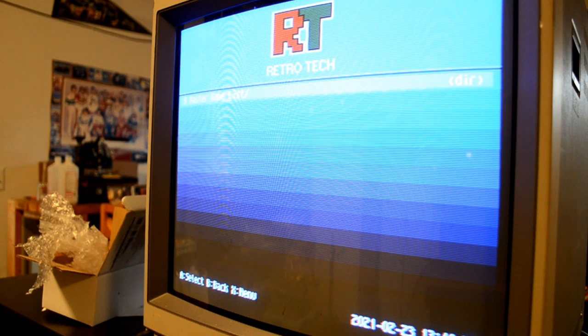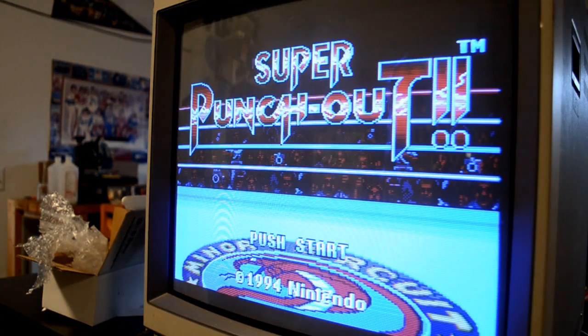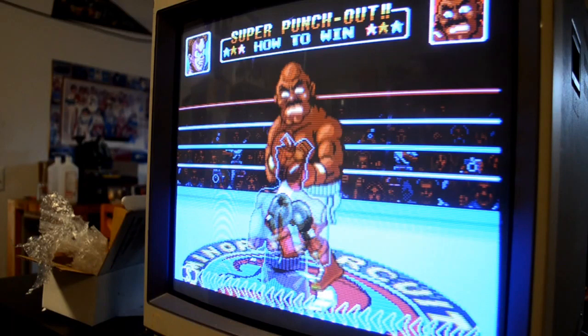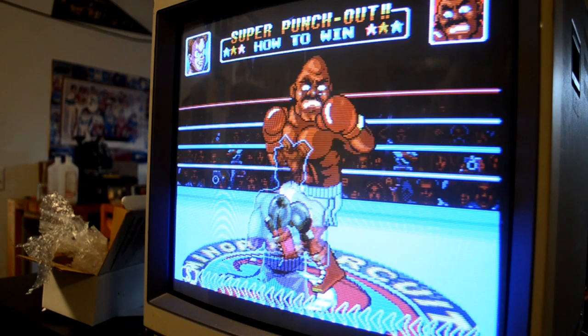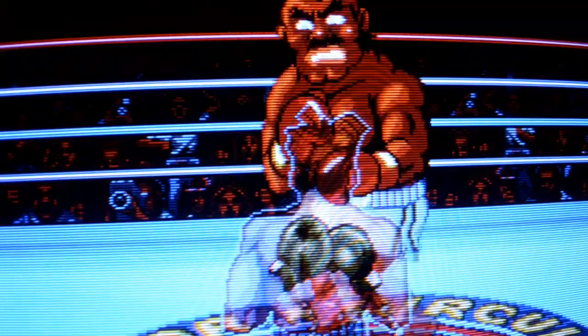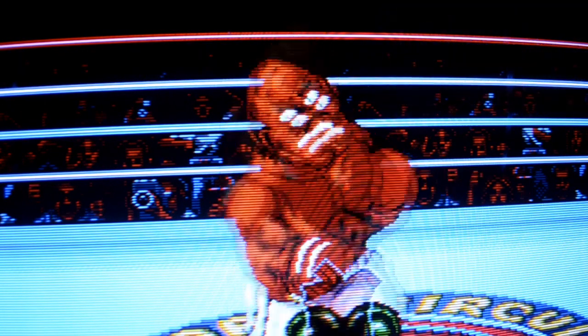I just did want to show, though, again, before footage of this monitor, because I often get asked, what does it look like prior to me recapping? And this is before I recapped the monitor or before I did really any work to the monitor. I just turned it right on, and this is what it looked like. Again, it looked quite blurry because of the convergence. The convergence was a big issue on this one.